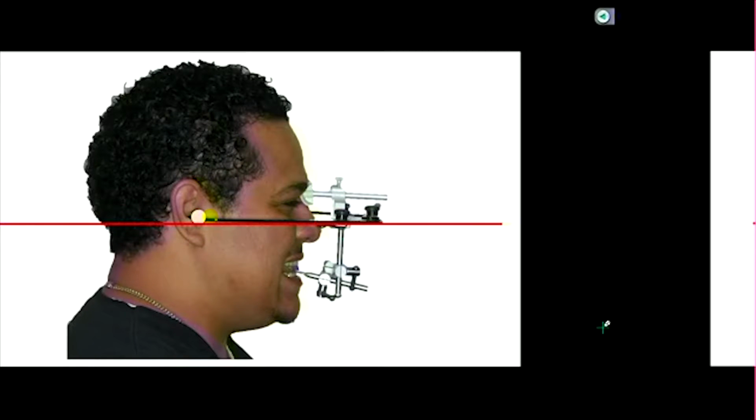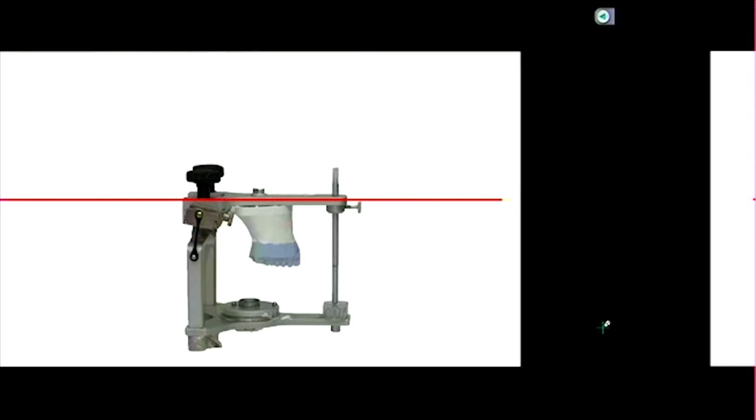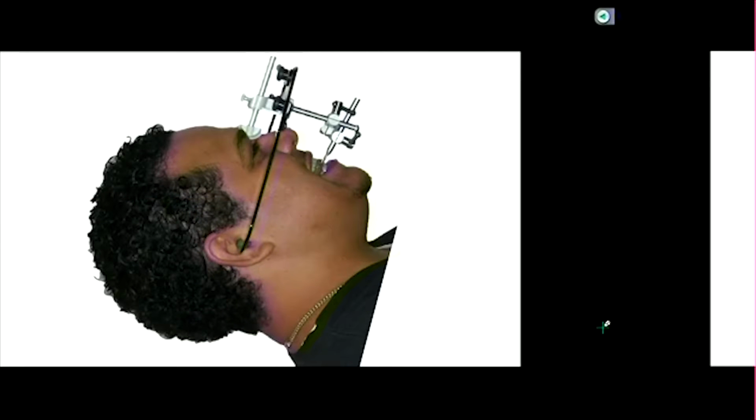Okay, so you can think of this line here, part of your face bow. We want to try to orient that according to the horizon. And on your articulator, obviously this is parallel. The top member of your articulator is parallel to the floor. Think of it that way. So really the story is if you've got a third point of reference, it doesn't matter if the patient's standing up and you do the face bow, laying down, they can be upside down even, right? You're able to capture that in relation to the Frankfurt horizontal plane. So that's the point of that slide.